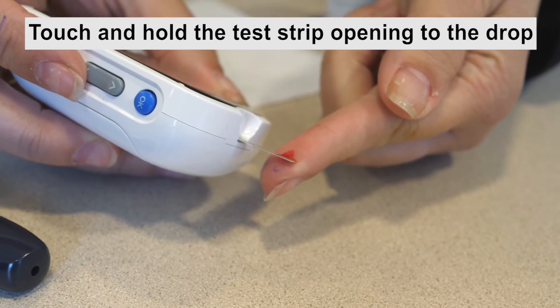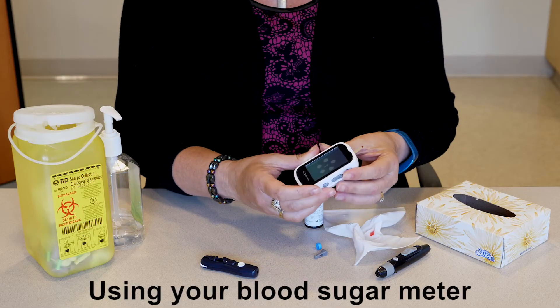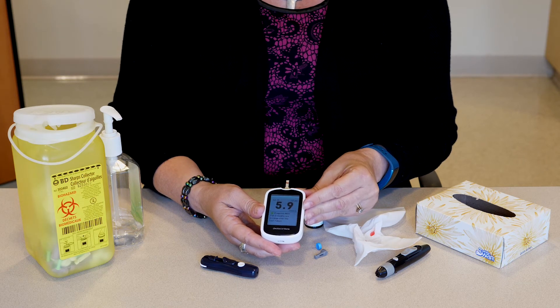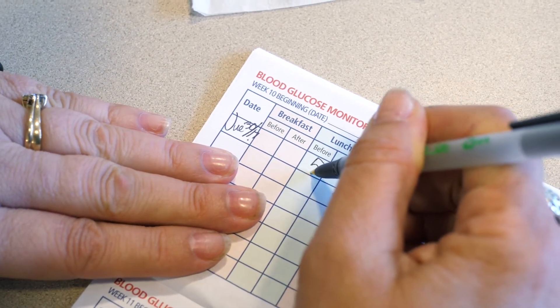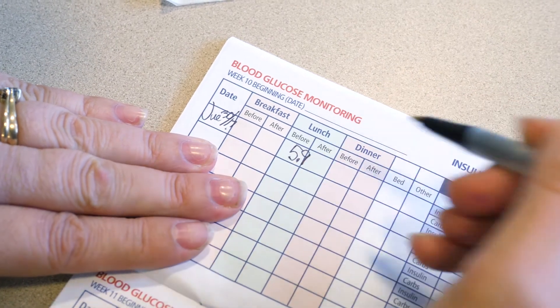Touch and hold the test strip opening to the blood drop until it has absorbed enough blood to begin the test. Part 3: Using your blood sugar meter. You can view your blood sugar results on the meter screen. You may want to write the result in a blood sugar diary, then take the proper steps to treat your blood sugar if it is high or low.